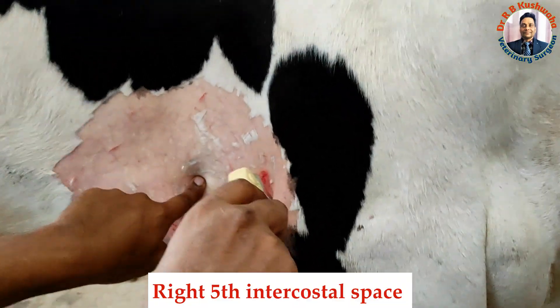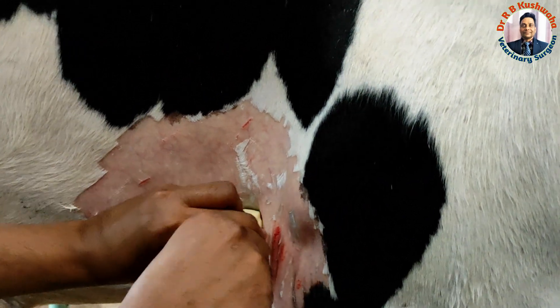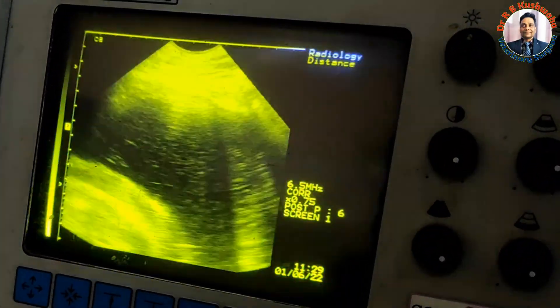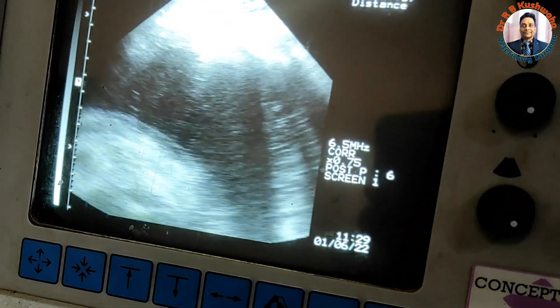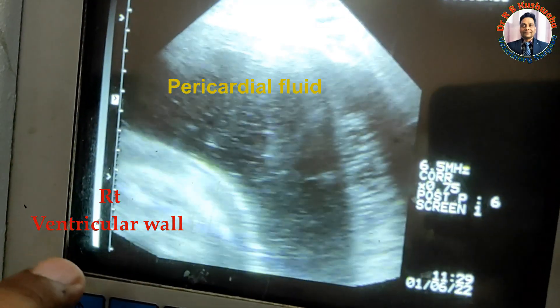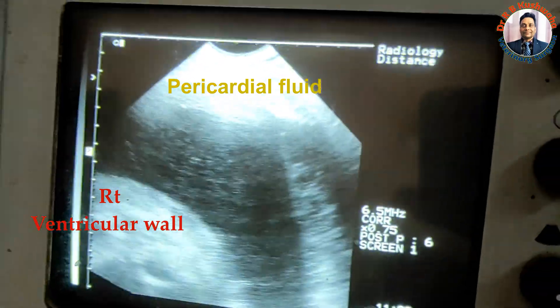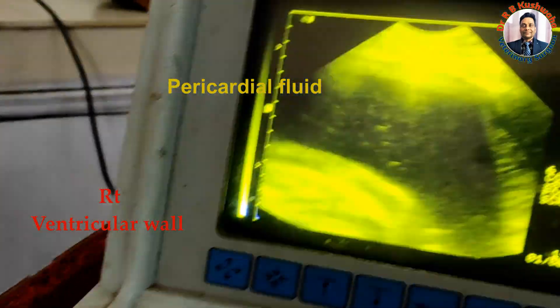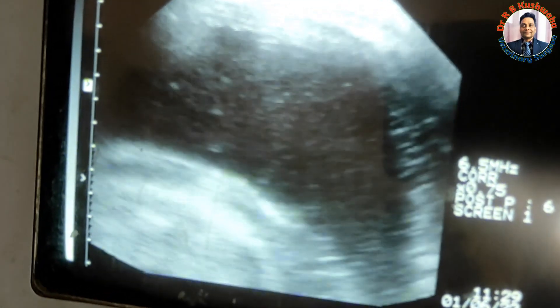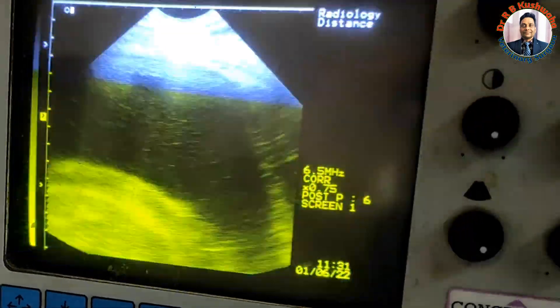This is the 5th intercostal space, and this is the 6.5 MHz transducer. You could see this is the wall of the right front — this is the right side. What you are seeing here is basically an anechoic area; it is nothing but fluid, and this fluid is pericardial fluid. This is a huge fluid accumulation, confirmed by the appearance on this view. This is a classical case of traumatic pericarditis as per the ultrasonography.